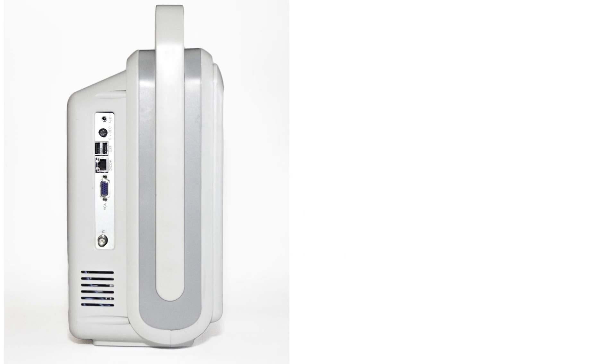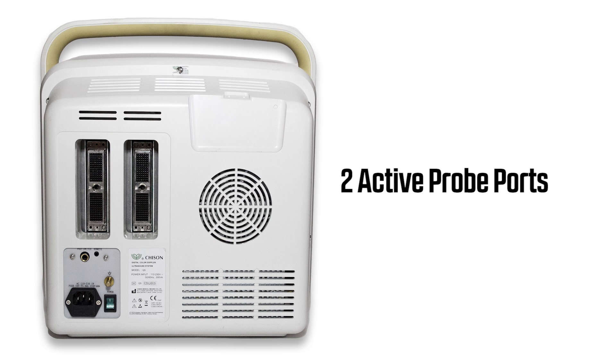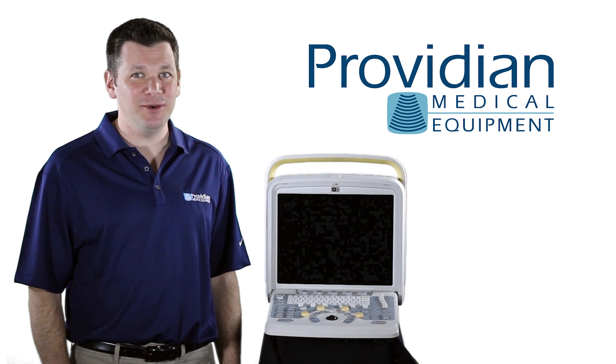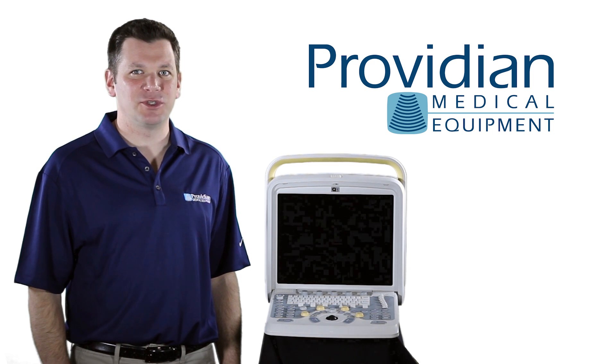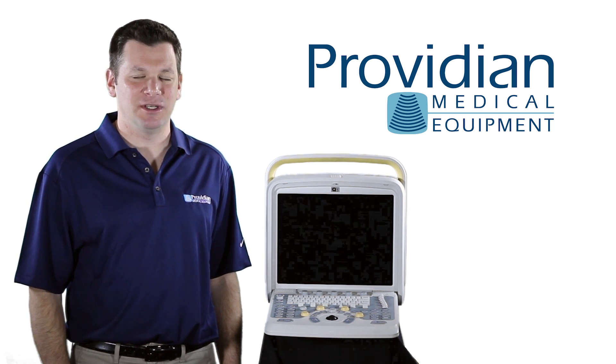It can perform a wide variety of functions and has plenty of connectivity options including two USB ports, S-video output, VGA output, and two active probe ports. Chison also allows access to the printer setup interface, which is quite unique. This allows you to connect to virtually any USB printer, something that's not found on many ultrasound machines today.